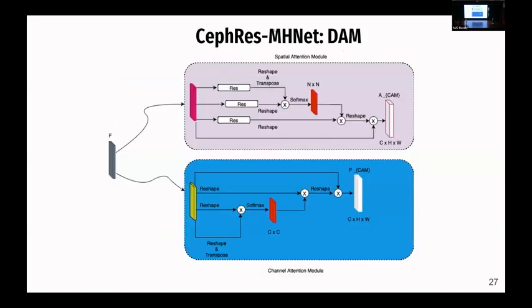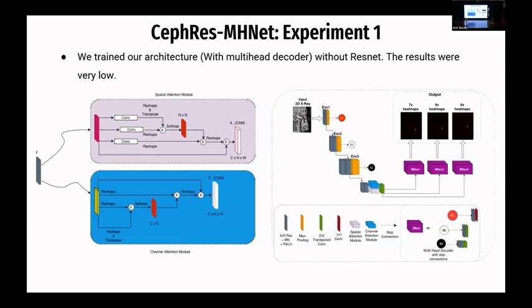The intuition is that instead of upsampling all the features, we are distributing the work among the decoders. And finally, at the bottleneck, we have the dual attention module, the spatial and the channel attention, to attend to the relevant pixels in the image and to the relevant features in the image. And that's all the technical part, so we have the experimentation and results with Jaheen.